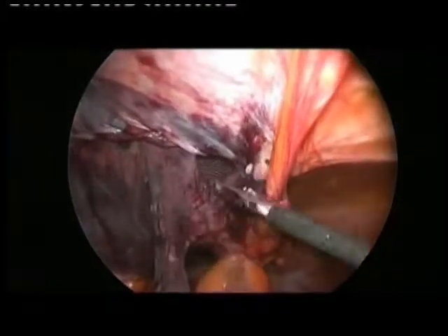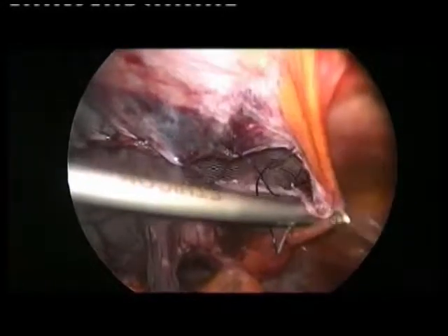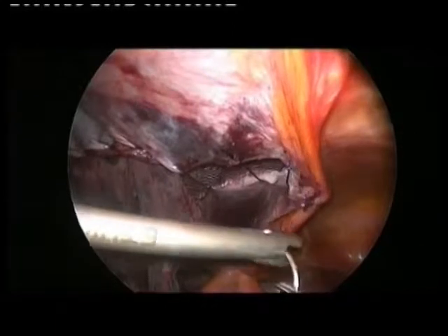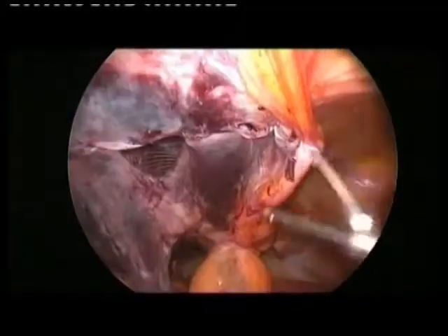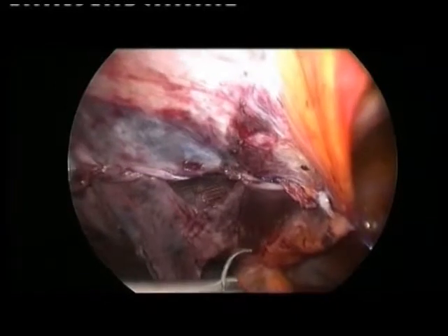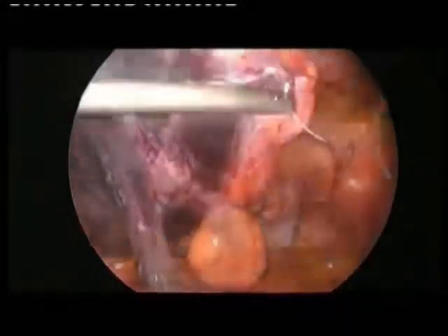I did this anastomosis also a few times in laparoscopy. But since we have to make an incision to take out the bladder and to construct the new bladder. This is the new bladder. This is the stitch that I put to find easily the site of the new bladder and urethra anastomosis.